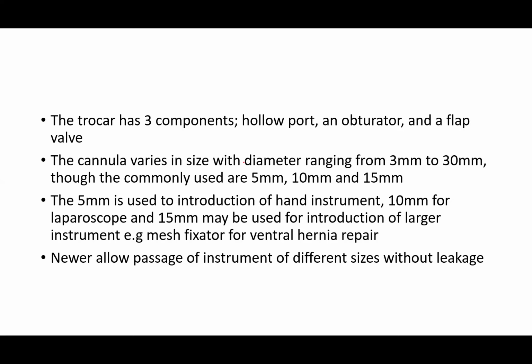The 5 millimeter is used to introduce hand instruments, the 10 millimeter for the laparoscope, and the 15 millimeter may be used for introduction of larger instruments like the mesh fixator for ventral hernia repair. Usually, during laparoscopic surgery, the first port you introduce is the optical port. That is the port for the laparoscope or the telescope, which is introduced through the umbilicus, above the umbilicus or below the umbilicus, and that is usually the 10 millimeter port.